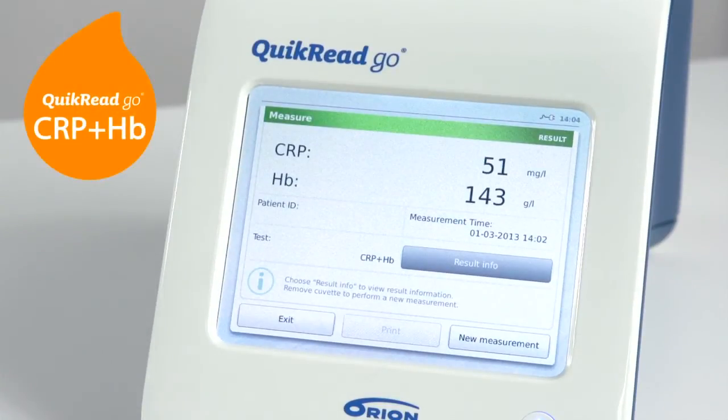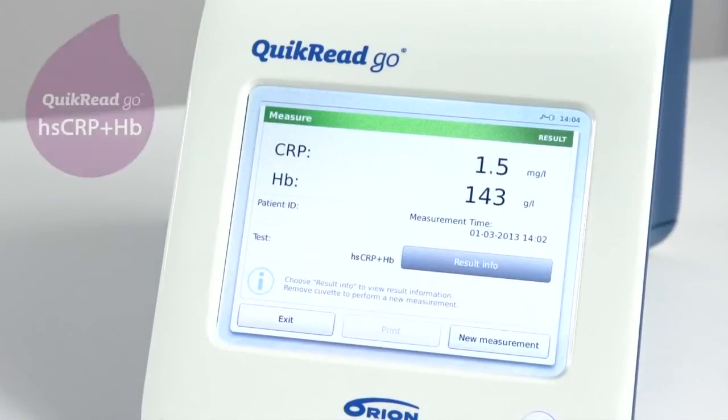If using combination tests, both the CRP and HB results are shown simultaneously.